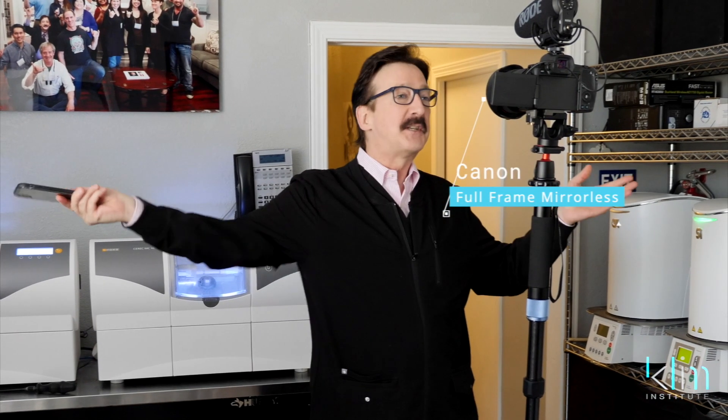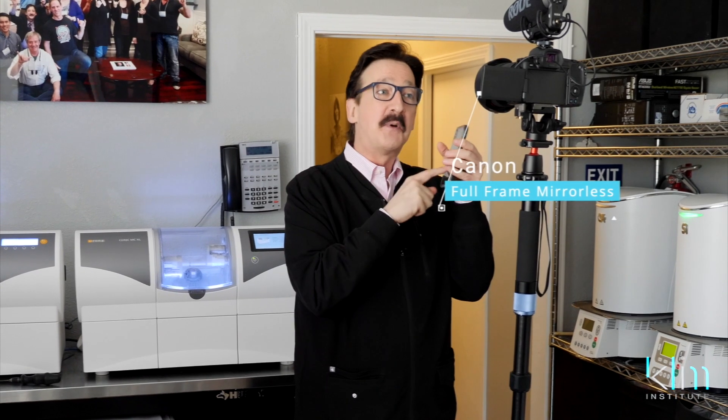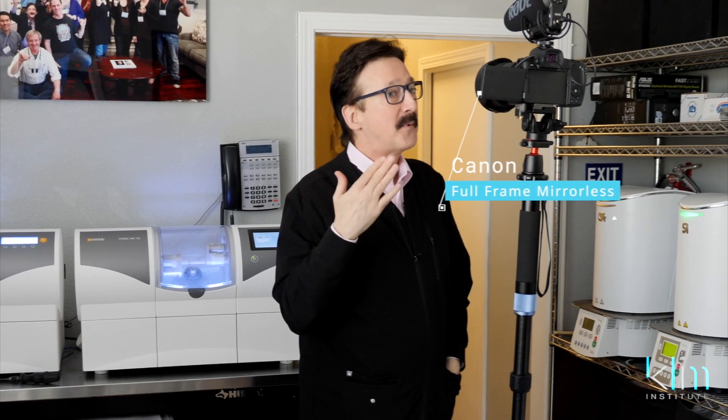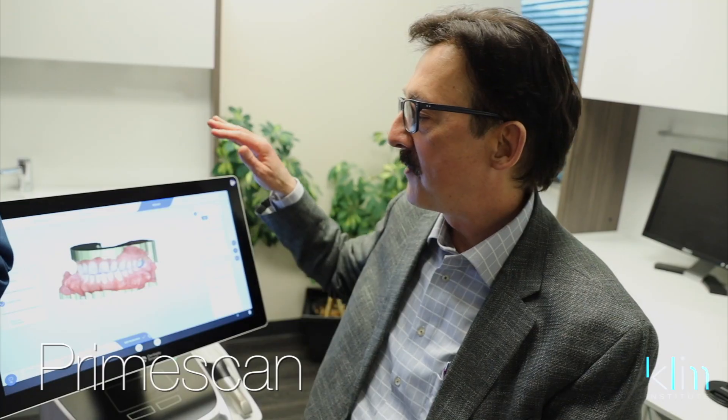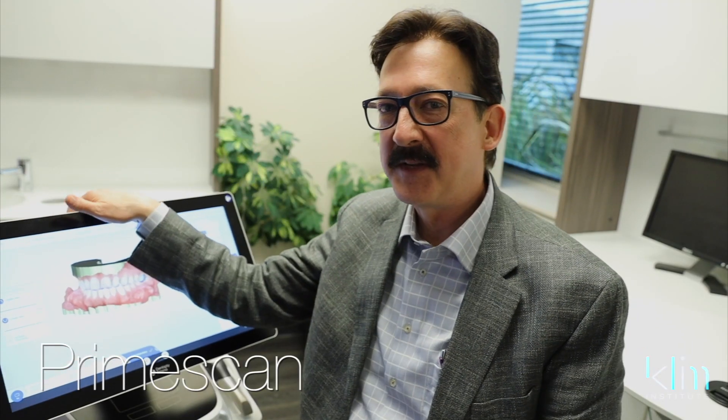In my opinion, I have no limitations with Omnicam. So what the PrimeScan is gonna do is just make that a little better. It's the difference of upgrading from one camera system to the latest release — the latest release will just have a few more technologies and applications that make it work better and better. And the same thing happened with digital dentistry, and it is a lot of money.